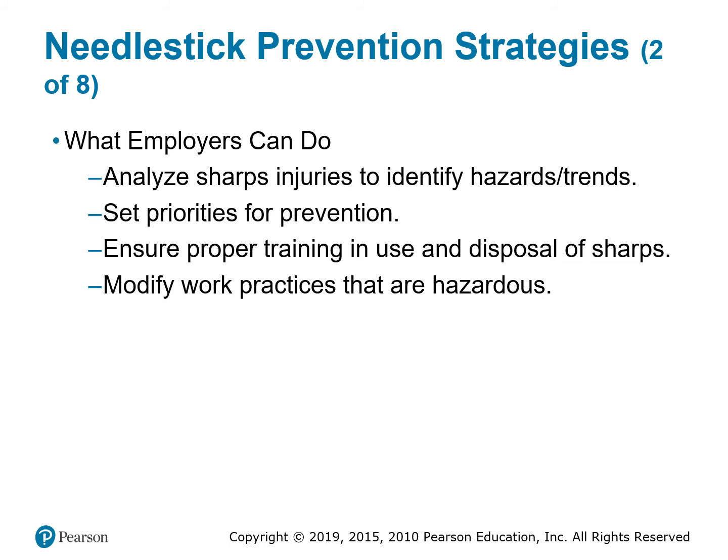We always have to make sure that we follow protocol and procedures when we're dealing with needles. That's a gimme. We always have to make sure we put needles in their proper sharps container. Sharps go in the sharps, biohazard goes in the biohazard waste. You never put sharps in a biohazard trash can and you never put biohazards in the sharps container. The two shall never meet in the same area. It's one for one, one for the other. Sharps are usually hung on the wall, or it's a little mini sharps that you carry on your tray. It all depends on what type of thing your facility has.